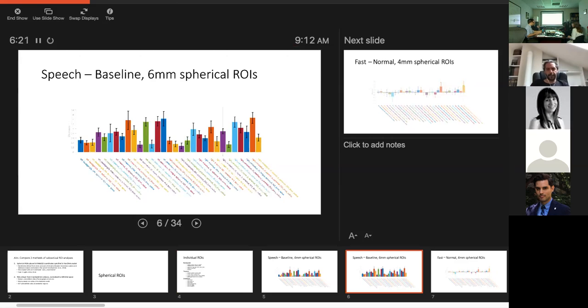I'll flip it. If you're defining on an individual subject, you go in and label the thalamus, and I labeled that subject's thalamus. In that case, you may not want to smooth. There still might be a little reason to smooth, but you could just not smooth, because you're literally extracting those voxels from that subject in that area, and you're confident of that. Here, we don't know how they're going to align, so the smoothing probably helps with that.